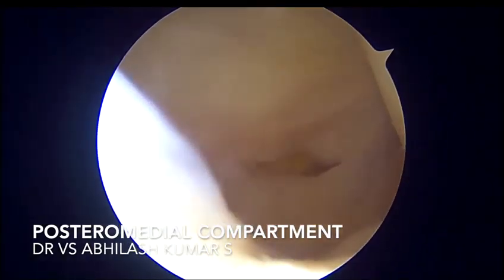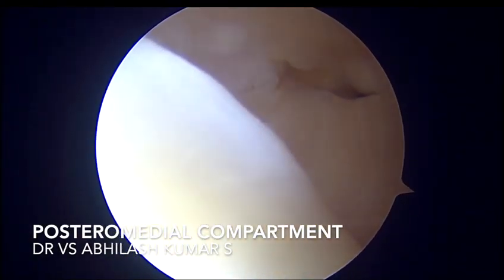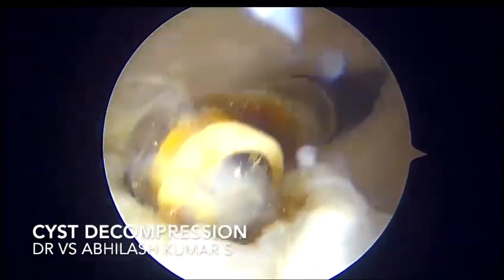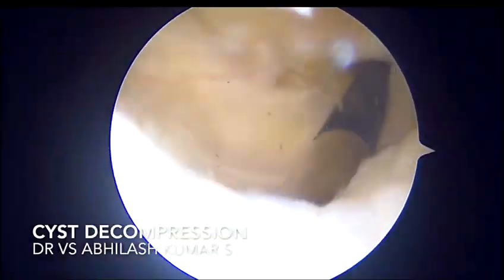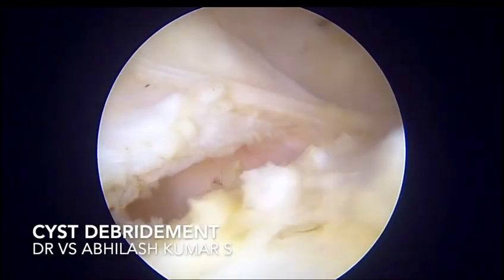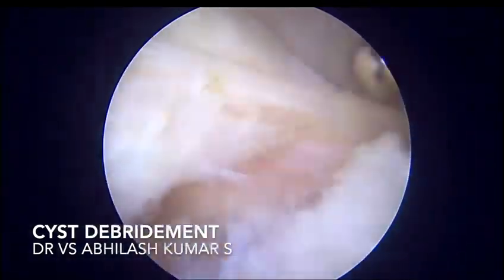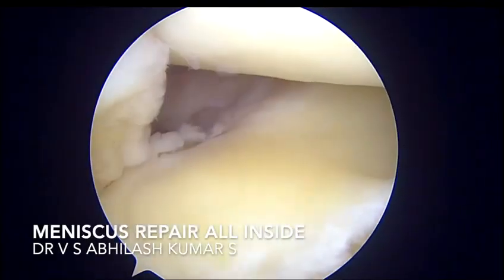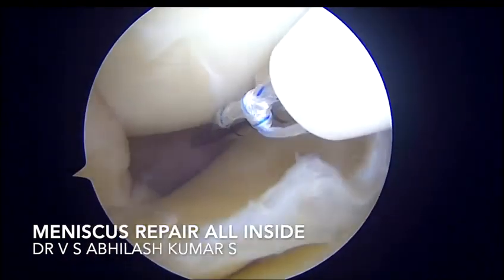The posterior medial compartment is entered, and you can see the cyst in the posterior medial compartment. A rent is made in the cyst. The cystic fluid is evacuated completely. Using a shaver, the walls of the cyst are abraded. The cyst is decompressed completely, and that's the tear which you can see.